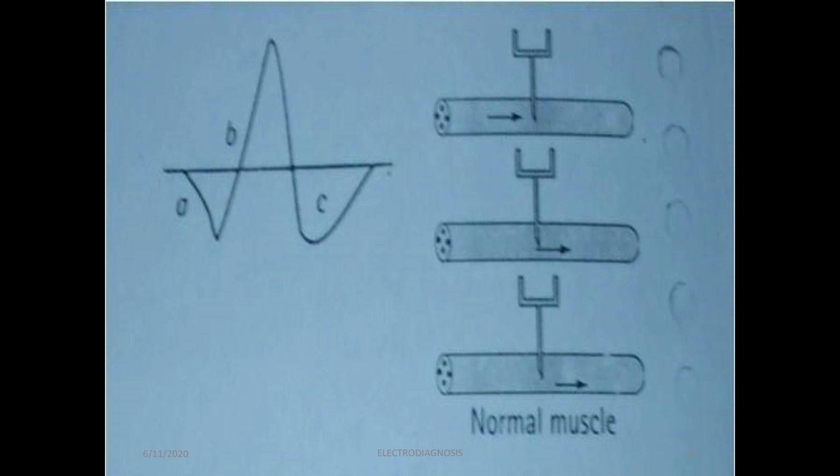But clinically, this amplitude of MUAP can be directly correlated with muscle strength. You will find many research articles also. So directly it can be correlated with MMT. The more your MMT, the more your amplitude. Clear? So you can use this MUAP amplitude of EMG for research purposes also, because it gives you an objective measurement of muscle strength. MMT is a subjective measurement, 1 RM, 2 RM is an objective measurement, and even better, it is your amplitude of MUAP.